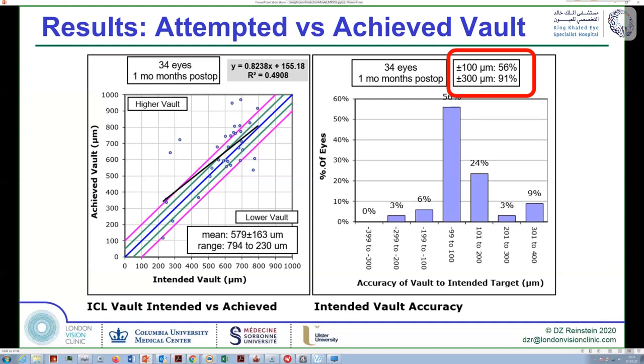And I have colleagues around that say it's 1%. I have colleagues that say it's 5%. So the percent exchange rate, whatever it is, it's too high because it should be 0, because it is a piece of plastic. We have measurements of the posterior chamber possible.